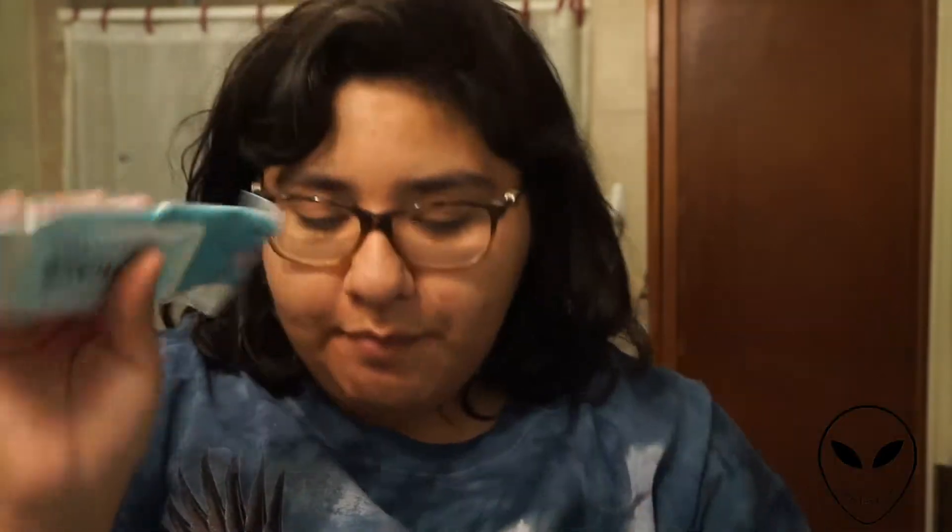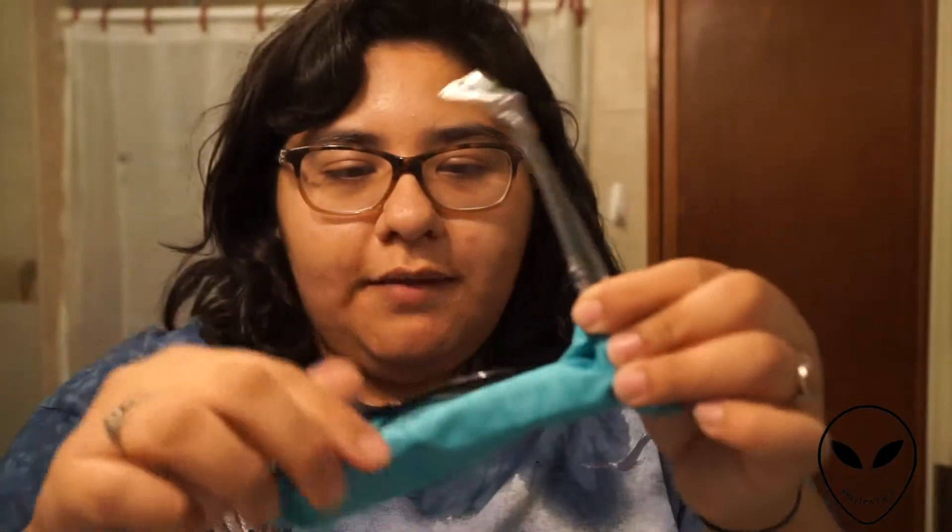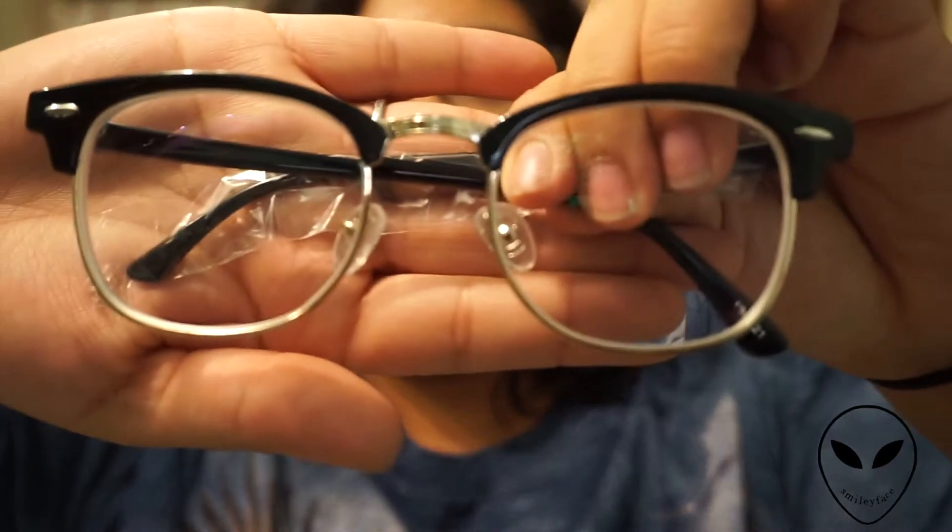Here is the first pair. It comes in a bag with your order number on it, and the glasses are wrapped up in a cloth with the Zenni logo. These are the first ones I ordered. You know when you get a new prescription and you're like, I can see clearly now? I can totally see clearly now because my old glasses were really, really bad.